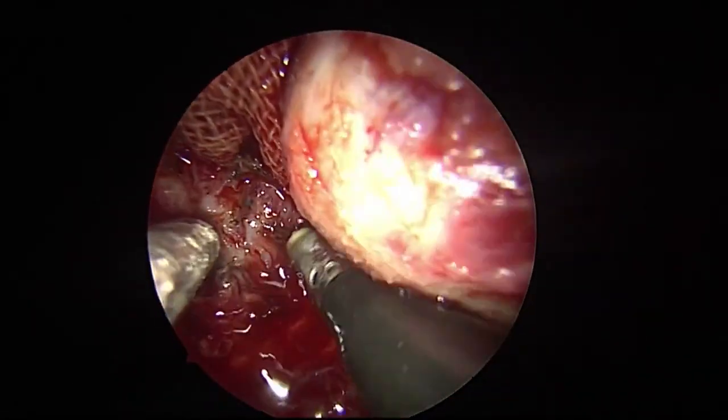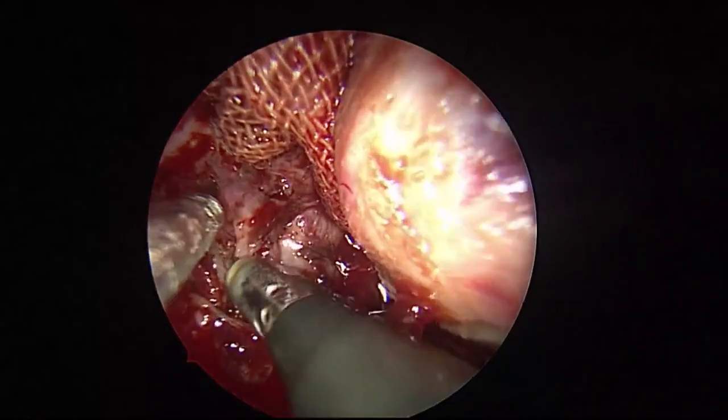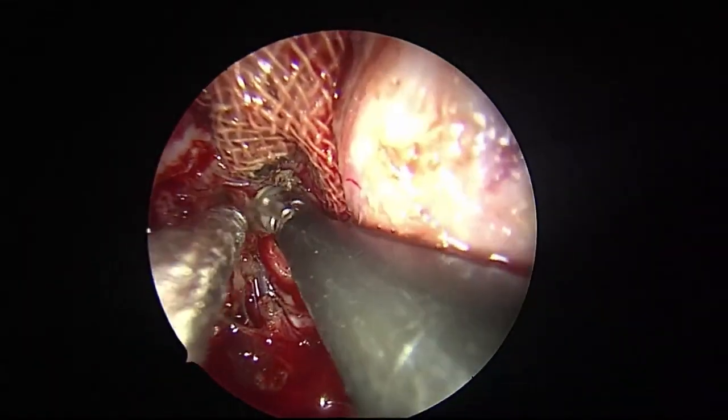This is excellent teamwork. Your suction is being applied. It feels as if you yourself are doing the suction. Excellent teamwork, sir.